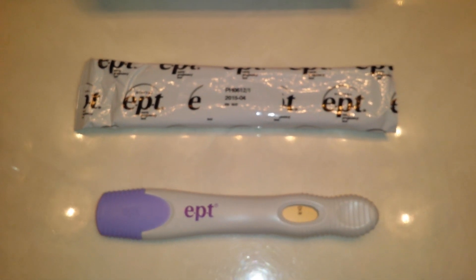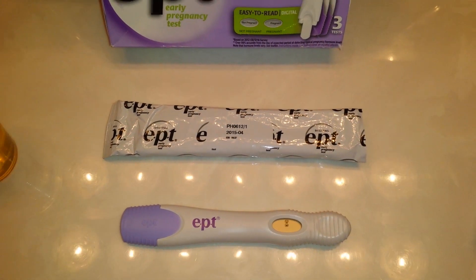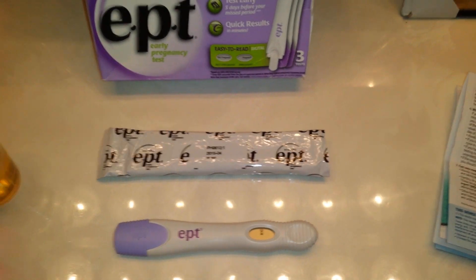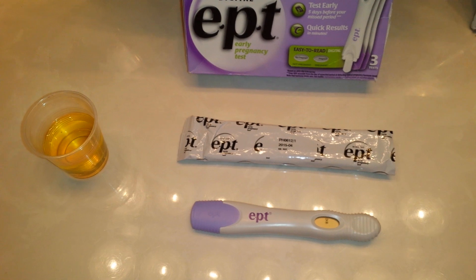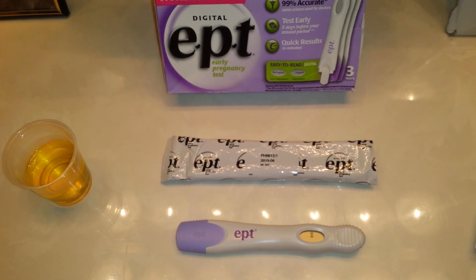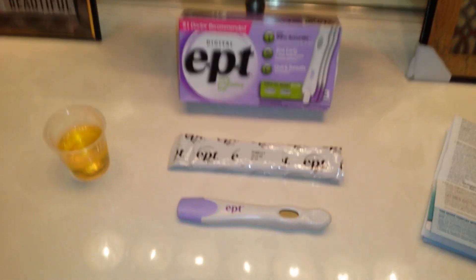In about three minutes — and it can be as early as one minute — the results will appear. The results will stay in the window for about 48 hours once you've taken the test, so if it comes up as a positive result and you want to show your husband or a friend, or post it, the results will remain for about 48 hours.